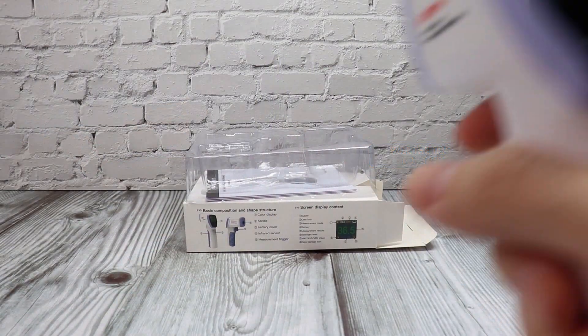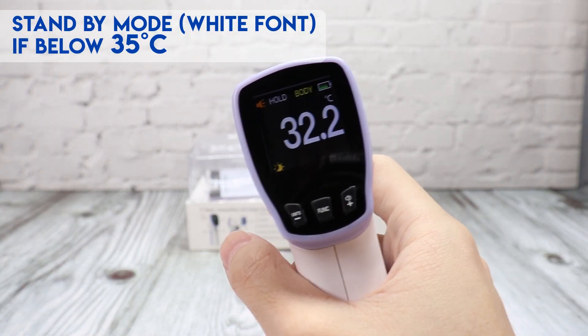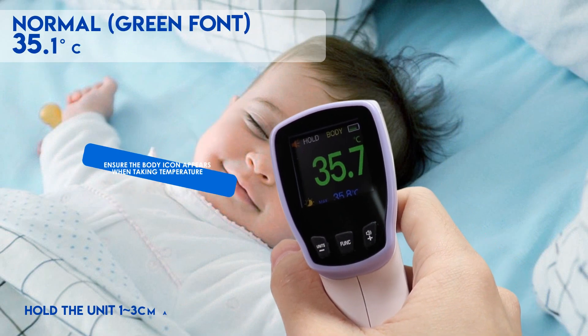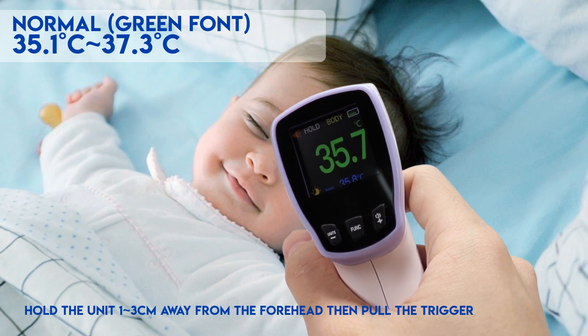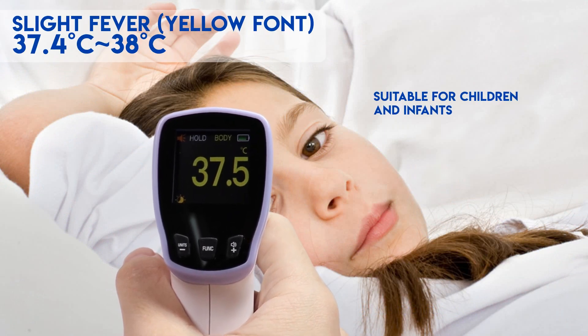If the temperature is below 35 degrees Celsius, the measuring font is white, which means you are in standby mode. From 35.1 to 37.3 degrees Celsius, the green font indicates normal temperature. This thermometer is suitable for children and infants.